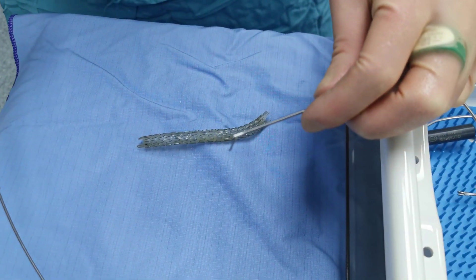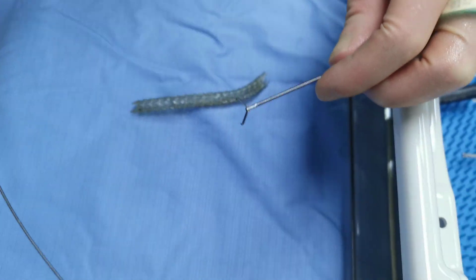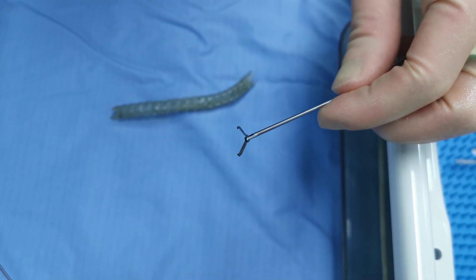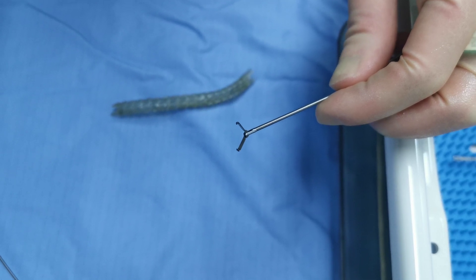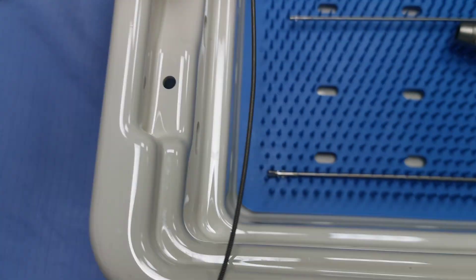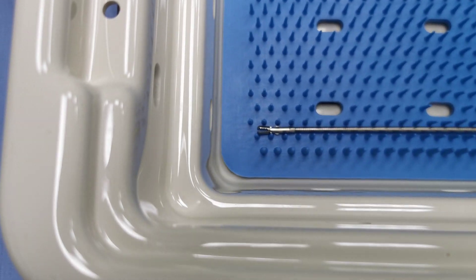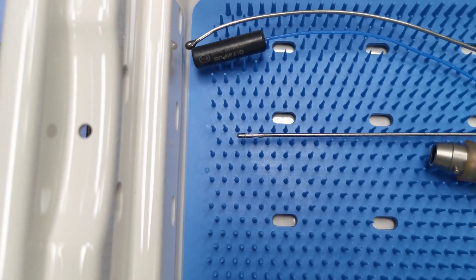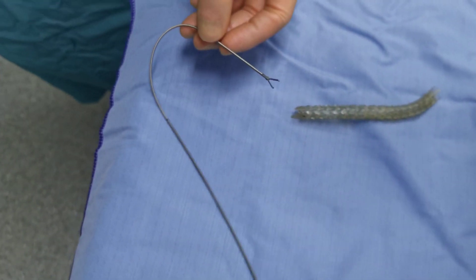Normally you'd remove them using one of these rat tooth forceps, which literally have very sharp teeth on the end — that's the only way you can really grab this to remove it. If you use the normal graspers that come with a cystoscope, or biopsy forceps, you'll find they don't have sharp enough teeth and they'll just slide off when you try to grab it.